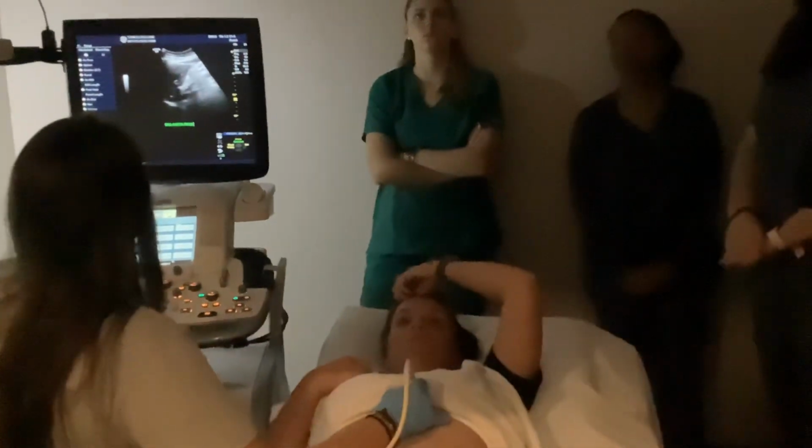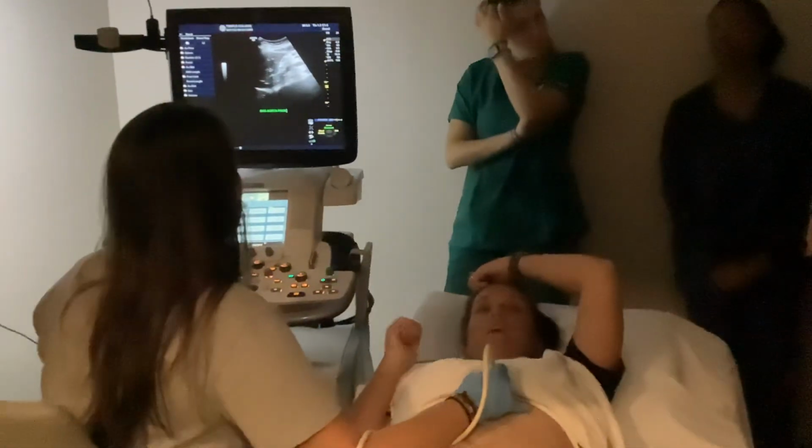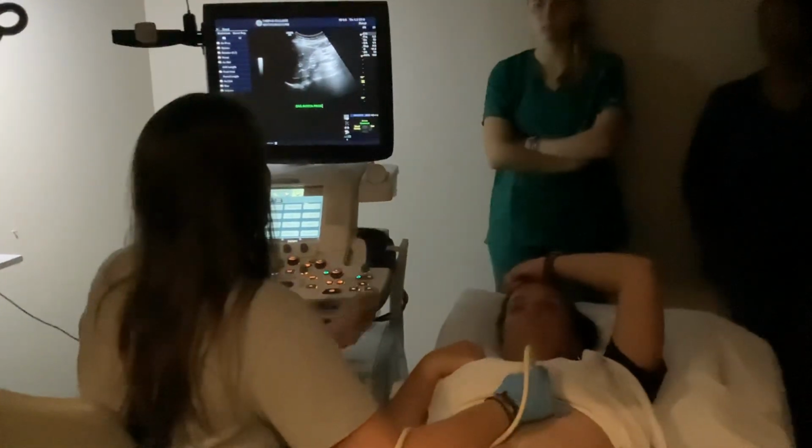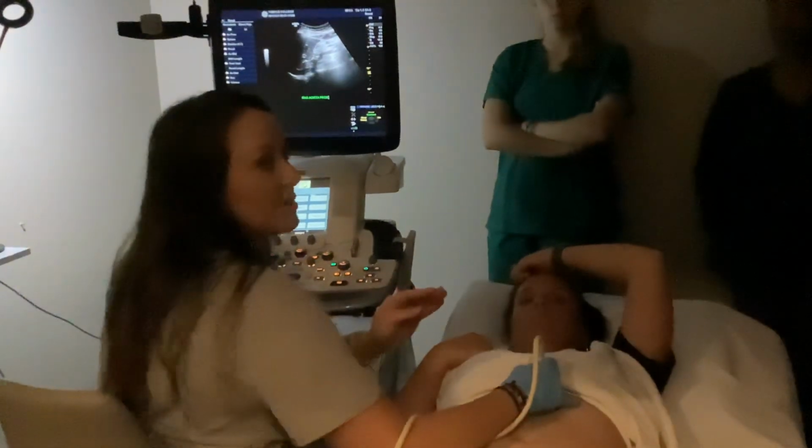In that order too. Don't switch them around. Every time you image from here on out, it needs to be the plane, the organ, and where on the organ. Does that make sense to everybody?